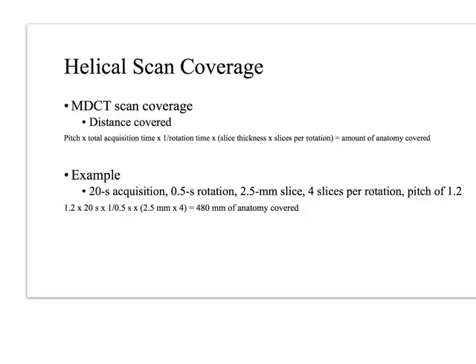And again, we typically think about this geometrically, when we draw our little boxes on there, but it's also helpful to think about this algebraically because it allows us to see every little technical detail of the scan. All these little technical details, the pitch, the acquisition time, rotation time, slice thickness, all of those have impacts on patient dose. They impact image quality. They impact noise, all of those kinds of things. So that's why I'm asking us to break this down algebraically.